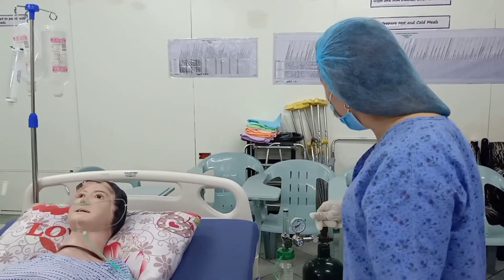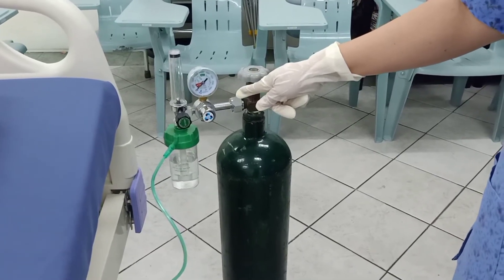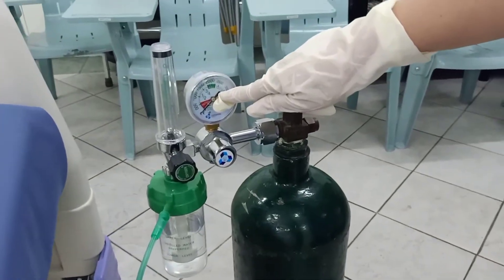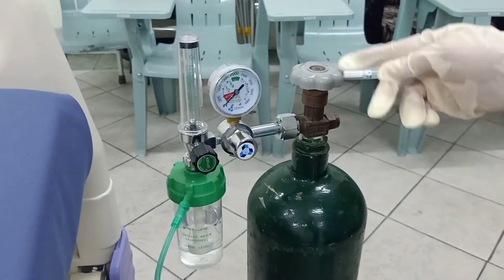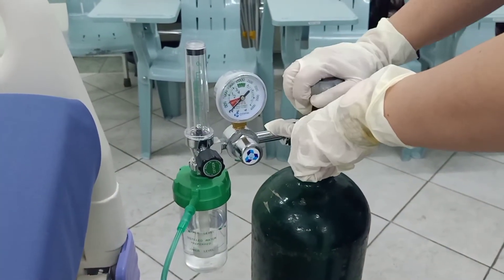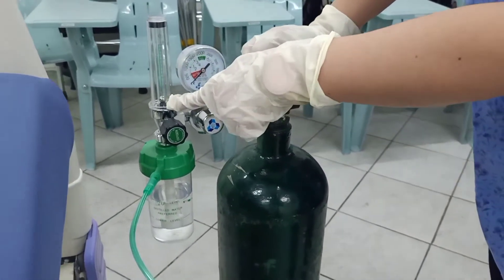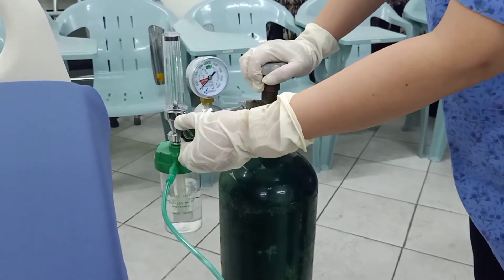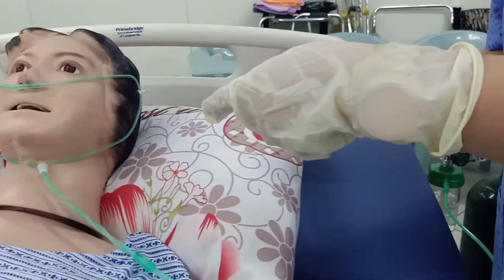First, check the gauge so that you have a baseline of the amount of oxygen the patient has used. Then close the control panel. Once the control panel is closed, the bullet will go down, meaning there is no air flowing. That is the time you close the regulator. Once the regulator is closed, that is the time you may remove the cannula.